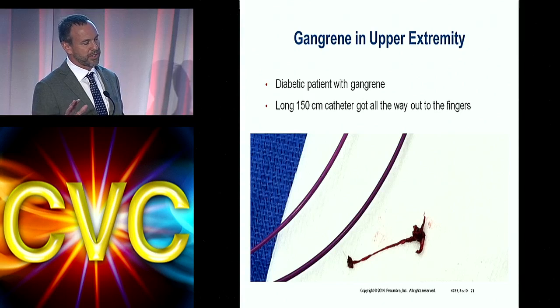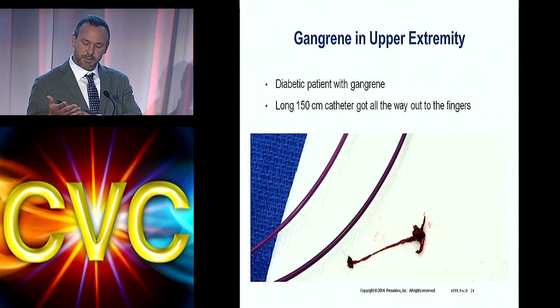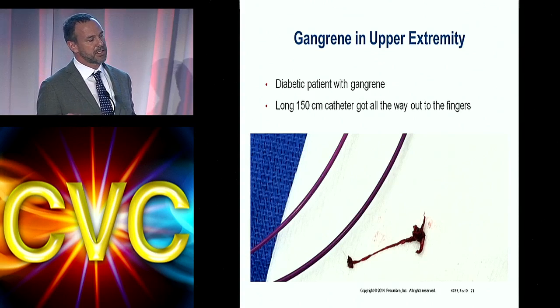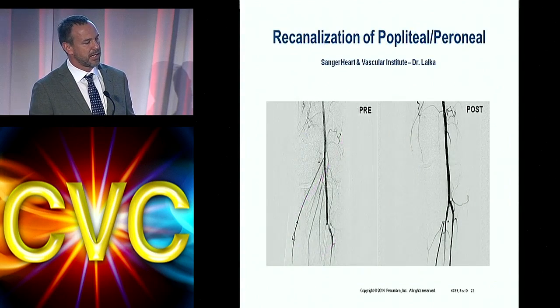I thought he actually just sort of acutely shut off his hand. Basically balloon angioplasty, the radial artery as well as the ulnar, and then went down all the way out into the arch of the hand, removing that, and was actually able to salvage his hand. Recently did one as well with a patient who had hypothenar hammer syndrome and had an ulnar artery basically clotted off, came to me with 3 ischemic fingers, sucked it all out, gave him some lytics all the way out into the digital vessels, but was able to actually salvage his hand as well.